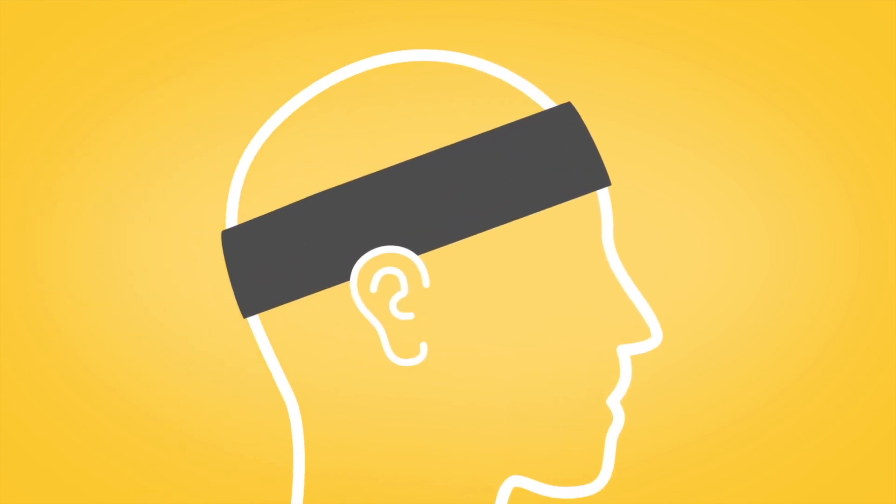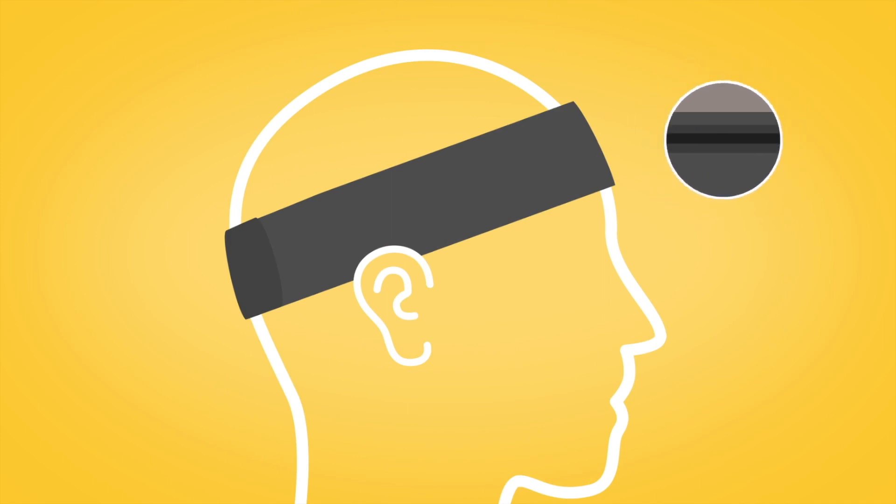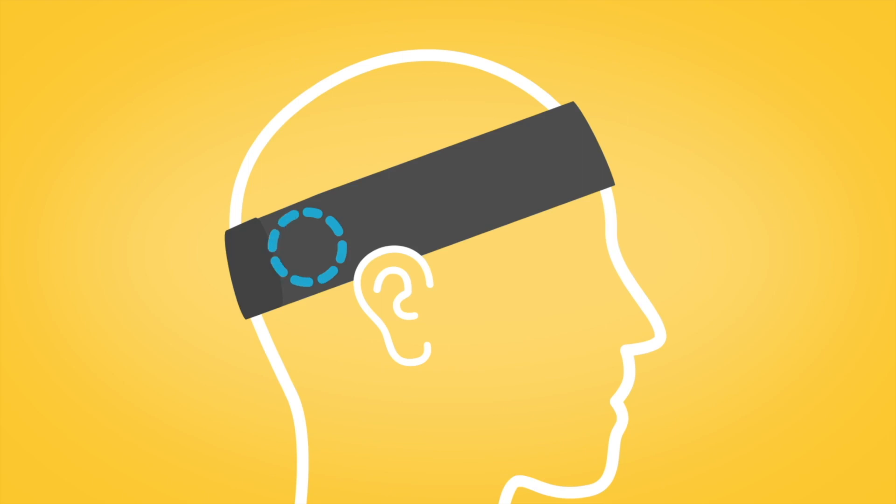Next, place the headband on your head, making sure that the anti-slip section is against your forehead, your processor is over your implant, and the headband fits firmly. Press firmly to ensure that the hook and loop fastener is joined securely.